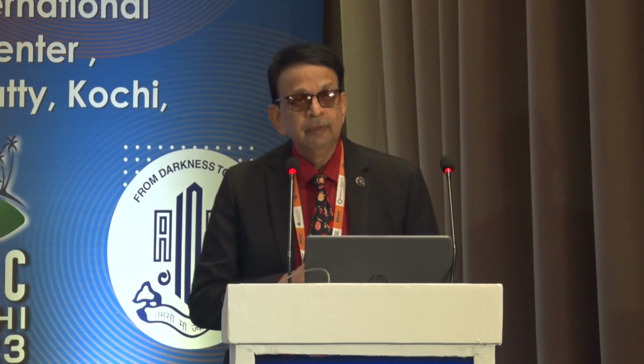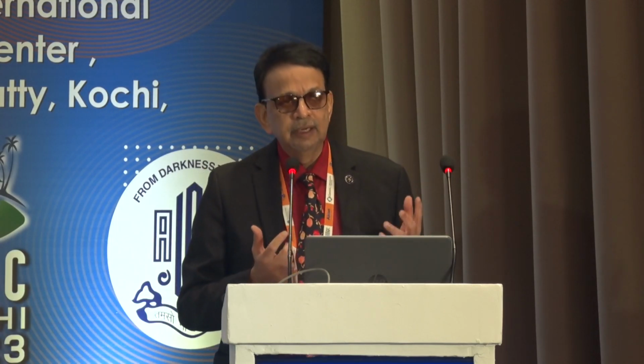So you are in double trouble because you have a small pupil as well as a hard brown cataract as well. These are the various scenarios wherein you can have. It's very common, not uncommon in a country like India. So what is the biggest problem? The biggest problem is the hard brown cataract, the posterior polar cataract, subluxated, or the pseudoexfoliation. The biggest problem is the small pupil. Why? Because in small pupil you are not able to see well, and that is the reason why you are not able to operate well, and that's the reason for all the complications as well.